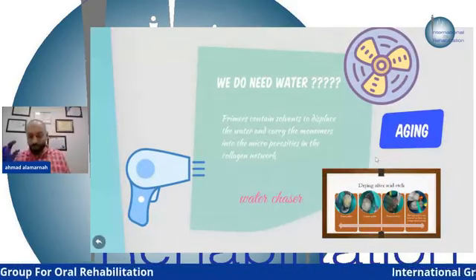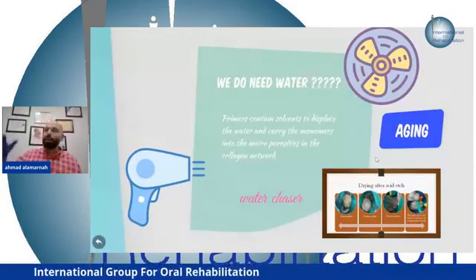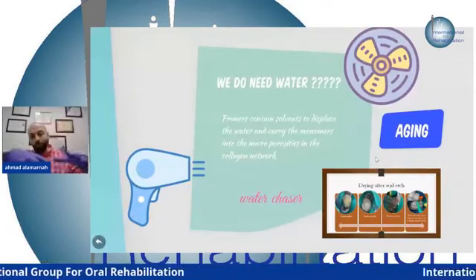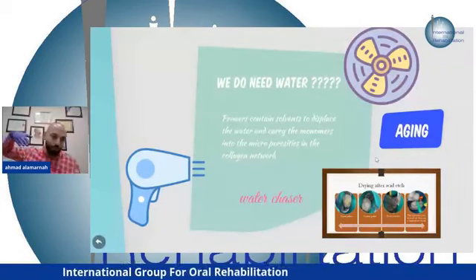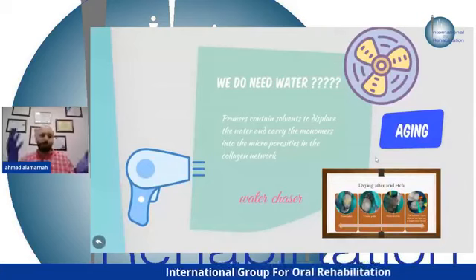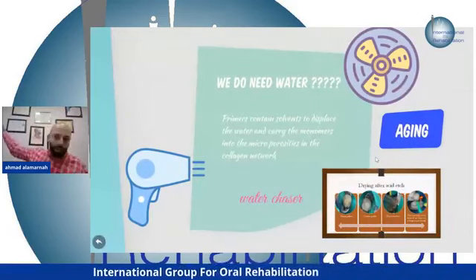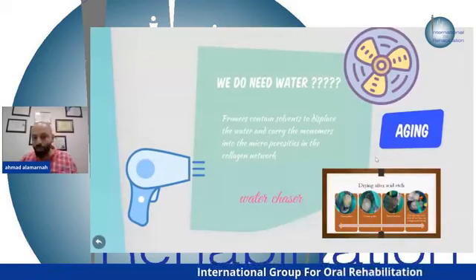So the solvent within the primer, which is let's say ethyl alcohol, will drag the bifunctional monomer of the primer within the collagen network and the dentin. So it needs water in order to pass through it. After that, the bifunctional monomer, which has the hydrophilic and the hydrophobic part, will do its work and bind the collagen, mainly collagen type 1, with the bonding, the unfilled resin from the bonding agent. So we need to have some water.